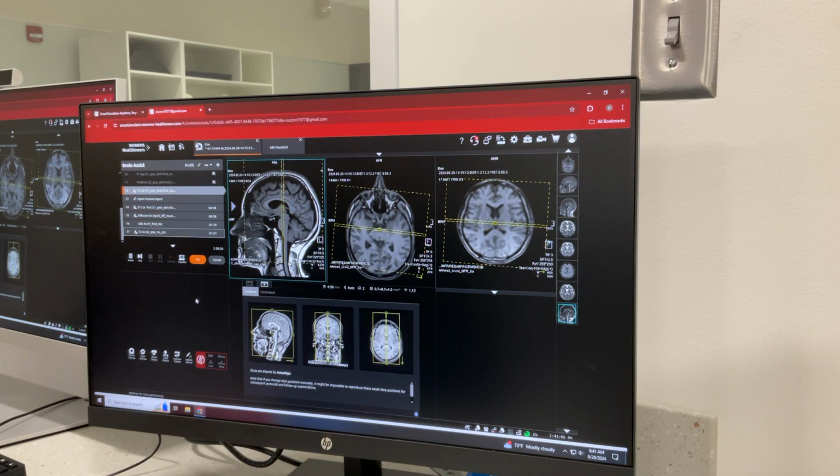I'll show you, that inject contrast tab right there, inject contrast agent. When you get to the point where you've run all of your pre-images, that's going to pop up. It's kind of like a pause, and then you have to put in how much contrast you're giving the patient, in milliliters. When you run your post, it attaches that to your post images, and the radiologist can see on there that not only is it labeled post, but it says down here 20 milliliters. It'll say how much contrast you gave the patient on their image.